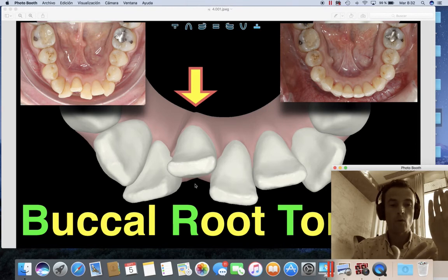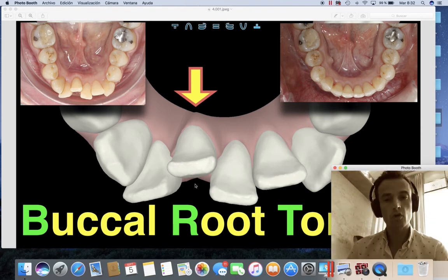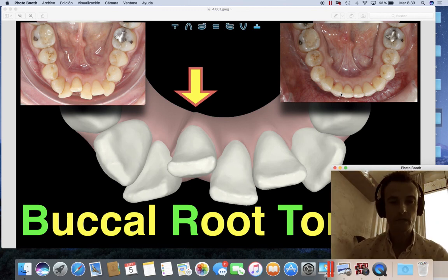So how do we avoid that? The way to avoid it is telling them that while they do this proclination, they have to add labial root torque at the same time. So you're not going to achieve a tipping movement — you're going to do a proper bodily movement. If you do that, you can compare the initial picture with the final picture, where the root looks perfect and we have exactly the same torque in both central incisors. A small tip to apply from today in your Invisalign cases.